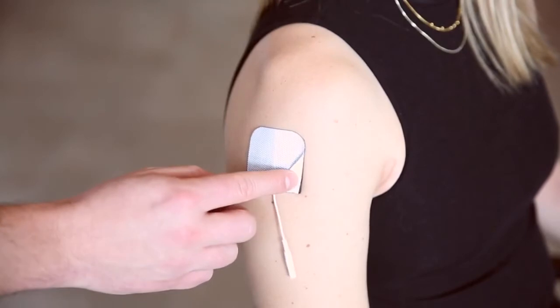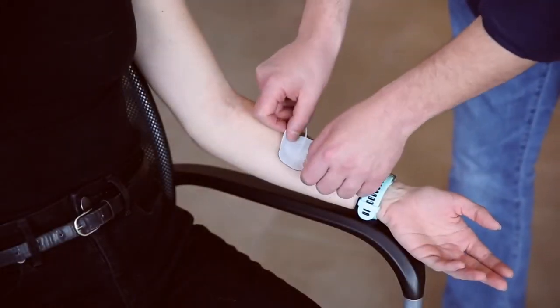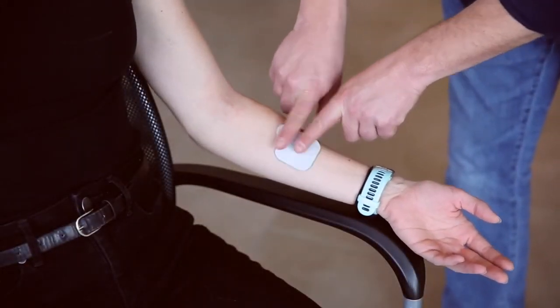Experience easy on, easy off convenience that only Bodymed can deliver with the new self-adhering electrode with tab.